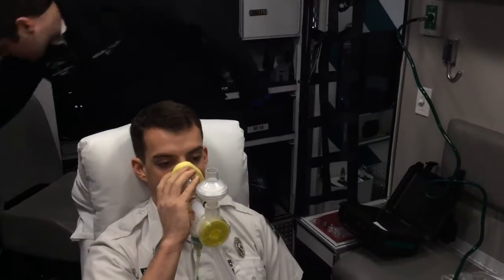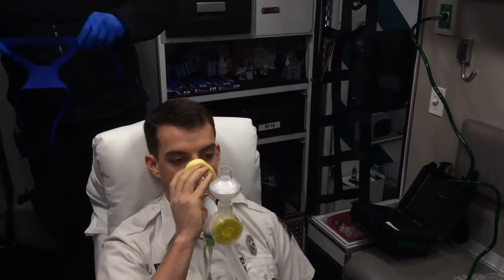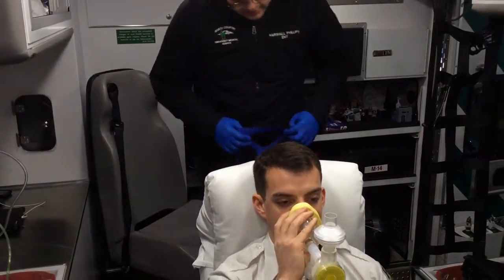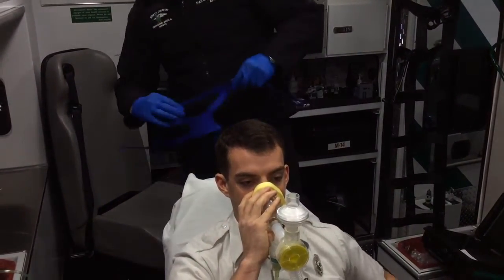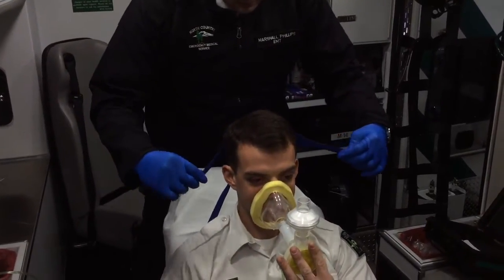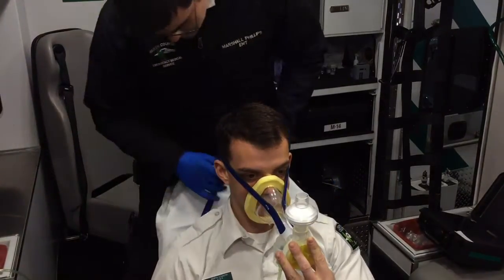At this point, we attach the straps. It's important to note that the thicker part of the strap is the bottom. If you have a partner, your partner will hold the mask, or you will have the patient hold the mask. Make sure the mask is tight and in place, affording a good seal.